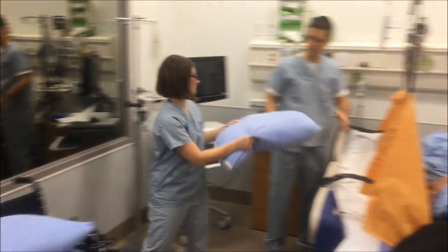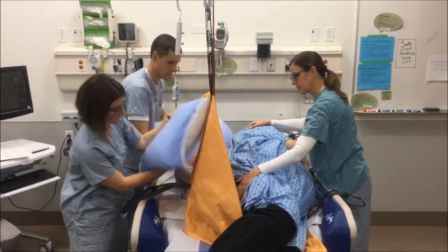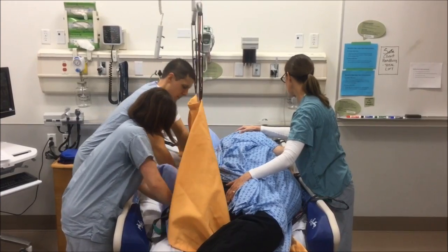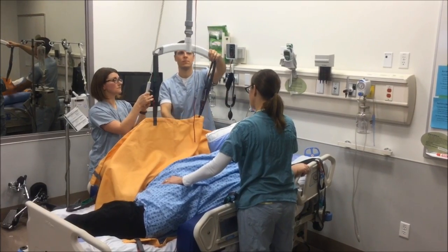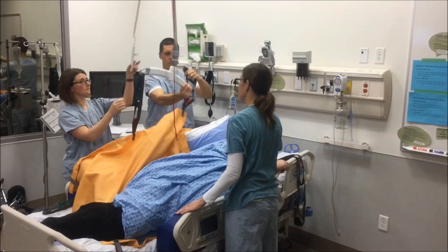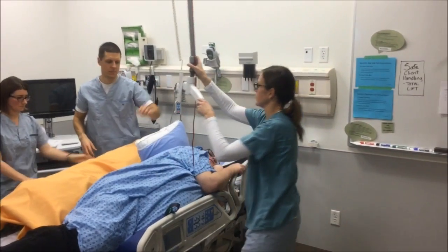The client should never be raised off of any underlying surface more than is required or be left unattended during any lift procedure. Use the lift or place passive devices to stabilize the client in supported side lying as demonstrated in this video. Detach the sling from the spreader bar. Move the lift away from the client and dock it. Remember to place all the bed rails up. For more specific product information and options, please contact the vendor directly.